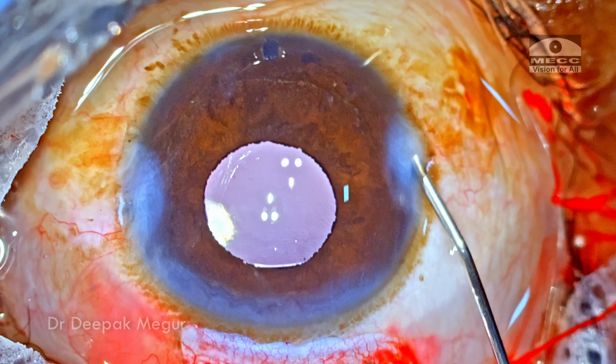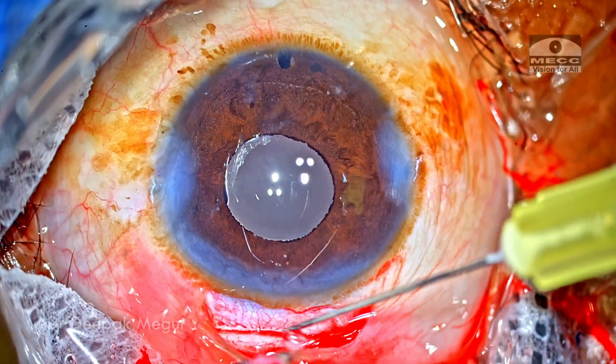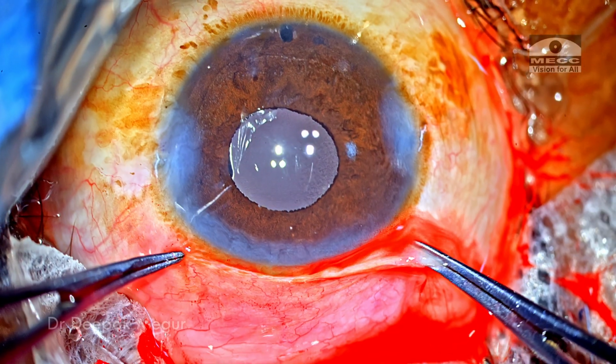Intracameral antibiotics are placed, the side ports are hydrated, the conjunctival flap is closed by using fibrin glue. That's it, the case is done. Thank you for your attention. I hope you found this helpful.